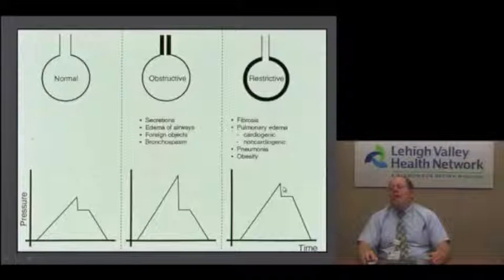On the other hand, if both the PIP and the plateau go up, all right, I'm going to know it's a lung problem. There's atelectasis, there's fluid in the lungs, the patient might be obese, so there I'm going to have to increase my mean airway pressure. In the obstruction case, increasing my mean airway pressure doesn't help much, maybe a little bit of PEEP splints this open, but increasing I time and that stuff's not going to be helpful. Here, it would be extremely helpful. So understanding the relationship between the PIP and the plateau pressure can be extremely helpful.